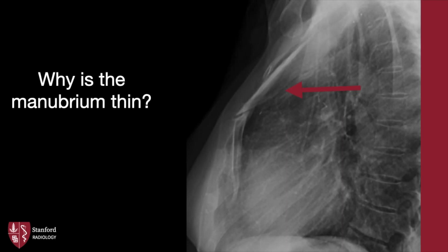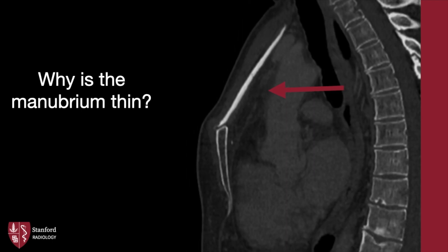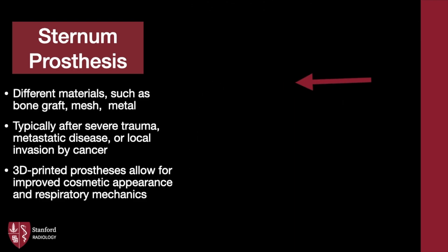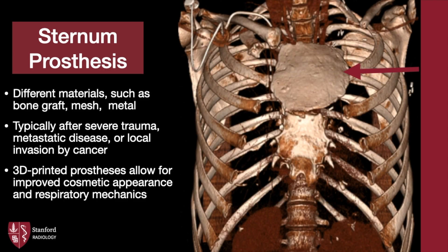We're nearing the end. In this case, why is the manubrium thin? Here's the follow-up sagittal CT. This is a trick question because there is no manubrium — it's actually a sternal prosthesis. This surgery typically occurs after severe trauma, metastatic disease, or local invasion by cancer. Today, with the advent of 3D printing, 3D printed prostheses allow for improved cosmetic appearance and respiratory mechanics.